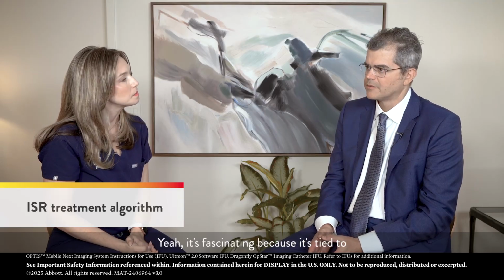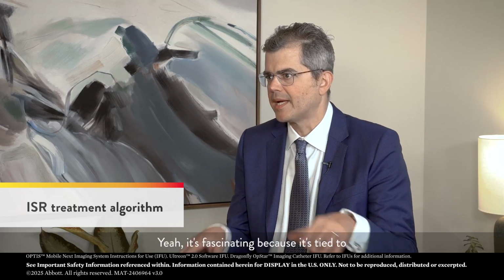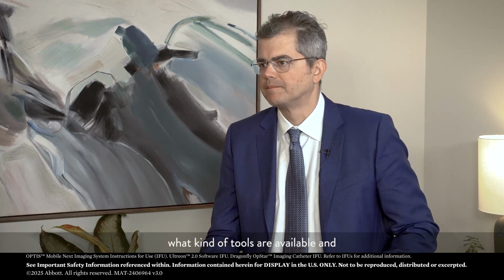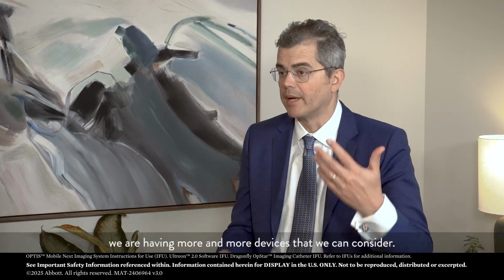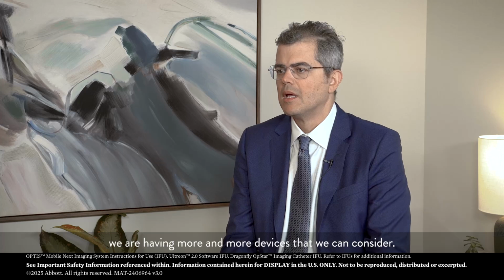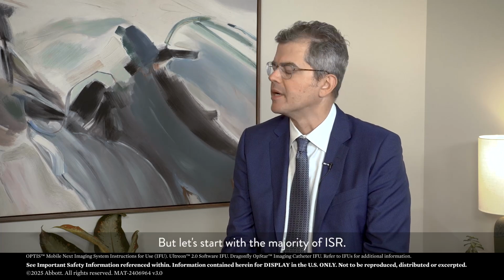Yeah, it's fascinating because it's tied to what kind of tools are available, and we are having more and more devices that we can consider. But let's start with the majority of ISR.